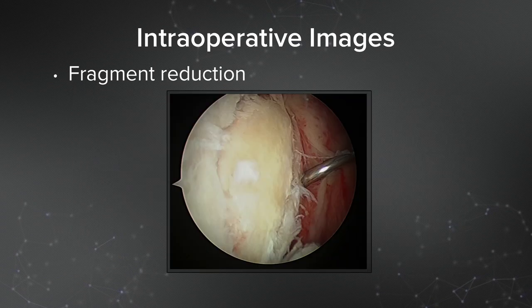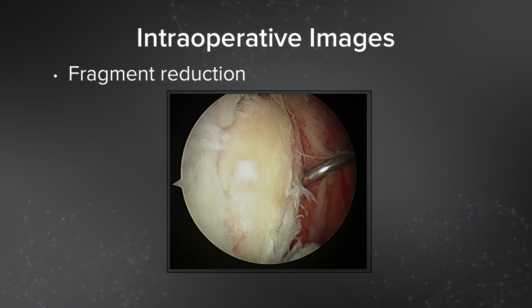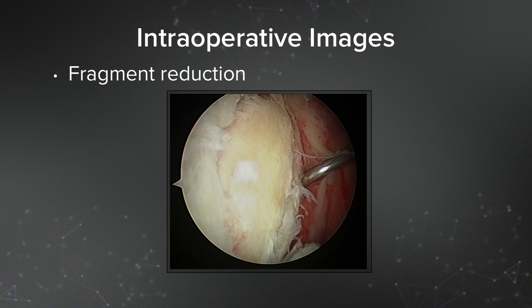Here is the fragment reduction. I've used a curved suture lasso — I like using it because it has a sharp pointed end, so you can spear and pin the fracture fragment in place. You can see here I have an anatomic provisional reduction just with the suture lasso.